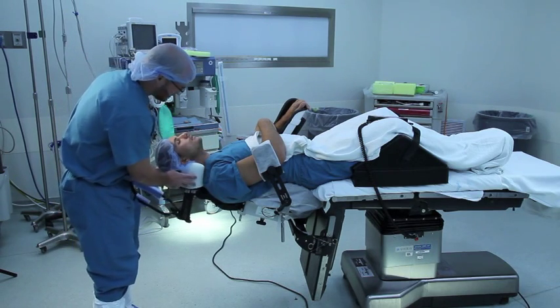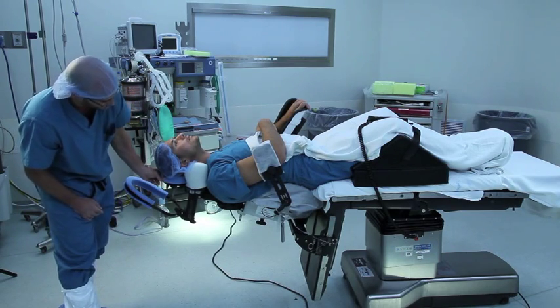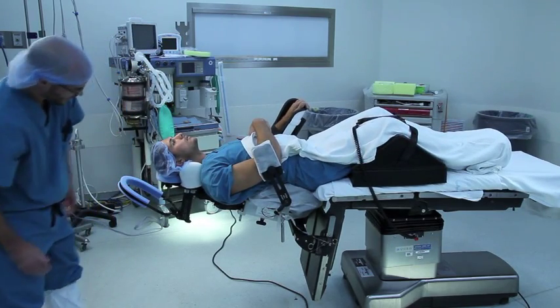To correct this, the neck pads are adjusted inferiorly. The patient can be asked to scoot their hips more in the crack. And this is much better.